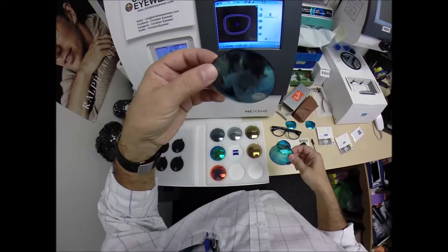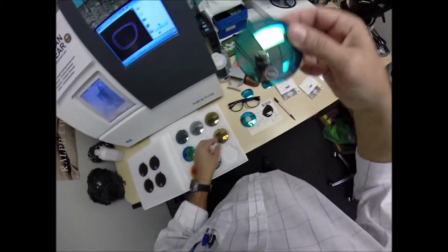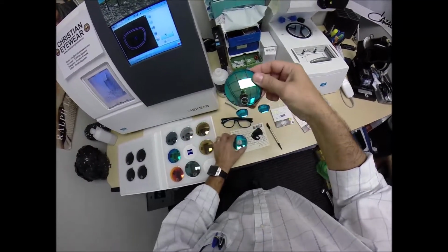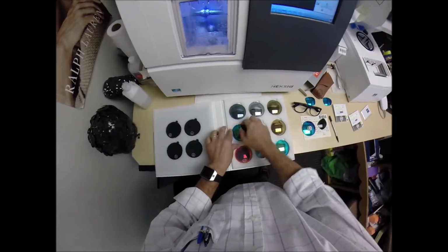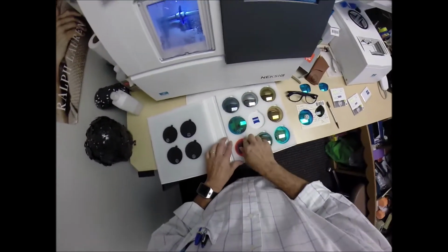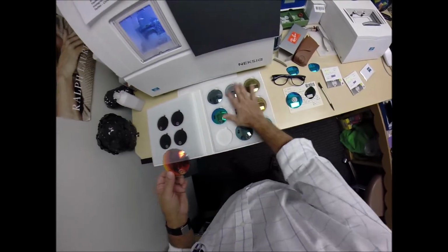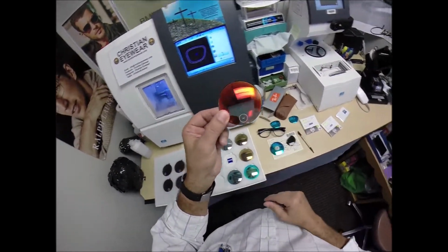There is a matte blue, which ironically they call blue, and the strong blue. That's what these are. This is the strong blue lens. Now there is a green. There's only one form of green, and there's only one form of red. Now I can do the video for all of these colors, but for some reason I can't block red.